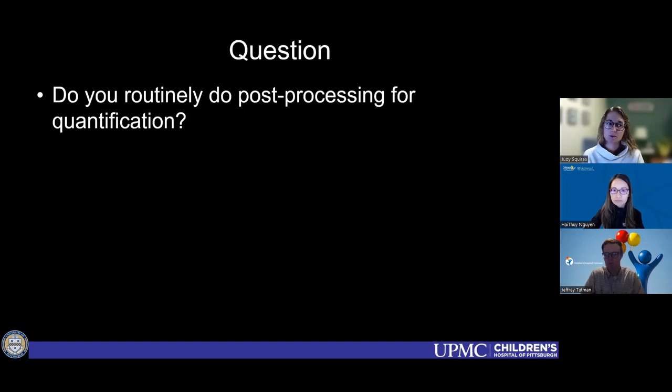So that's a huge area that really needs to be worked on in the contrast enhanced ultrasound community, because every time I submit a paper that has to do with contrast enhanced ultrasound, they ask me about quantification, but there's not great quantification out there for a relatively small time researcher like me.